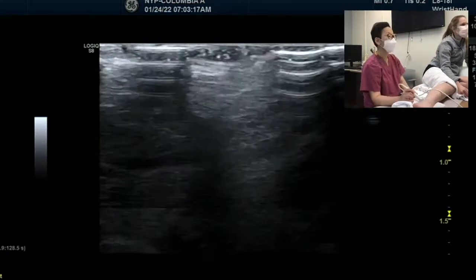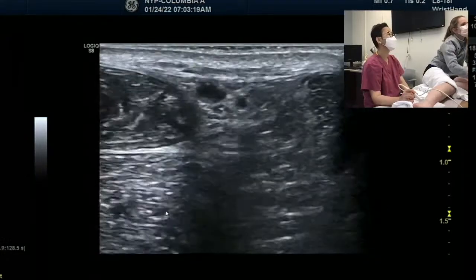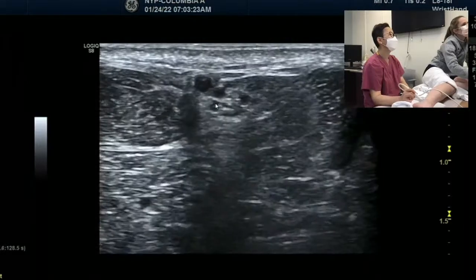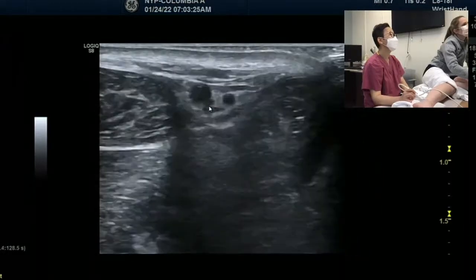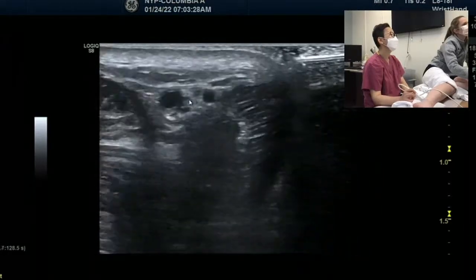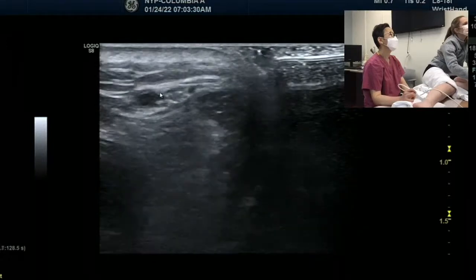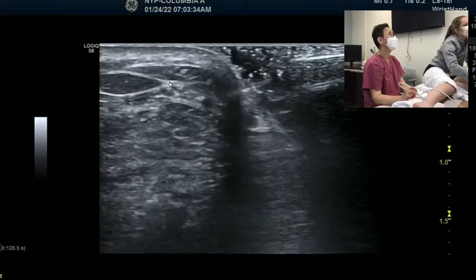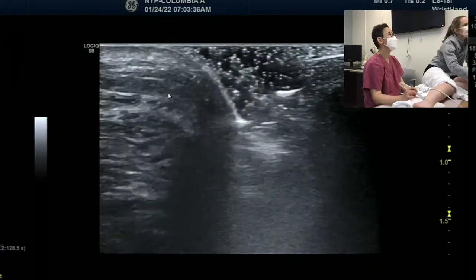Okay, let's use the cursor to follow the nerve. That's the sural nerve. Very clear here, see? I'm toggling, so I'm moving. Now it's starting to go up. It's going up, right? Now it's in the adipose tissues, right? And then I'm going to move continuously.